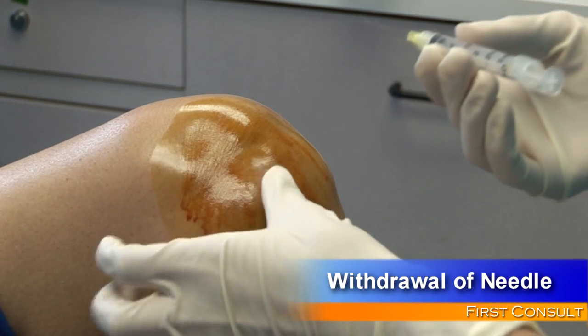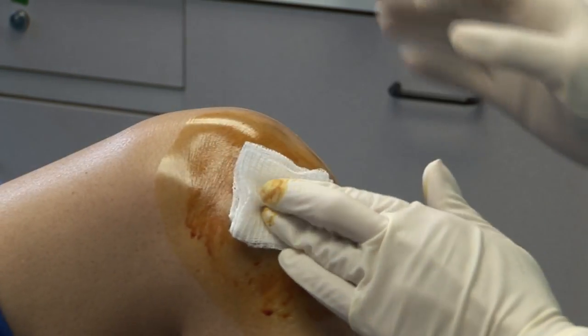Withdraw the needle and apply gentle pressure to the entry site. Cover with an adhesive bandage. The procedure is now complete.